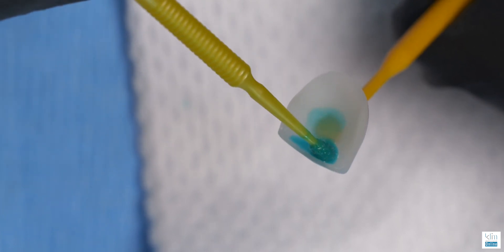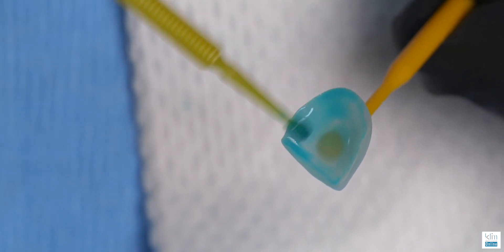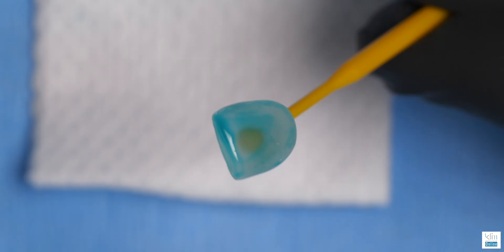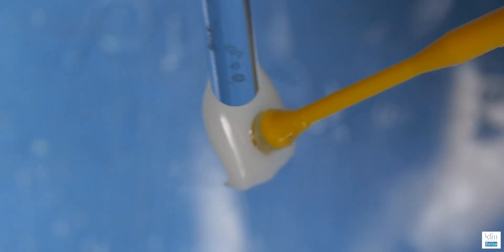Another question I get on this product: what do you do if something's coming from the lab and it's already been etched? You can use Modobon Etch and Prime on a restoration from the lab that's already been hydrofluoric etched. You've tried it in, it will clean up any debris on it, and it will also optimize that silane coupling process on the surface to get a strong bond. Now, what happens if it gets contaminated? You can go back and reapply the Modobon Etch and Prime with the same process without over-etching the surface, to still optimize the bond.